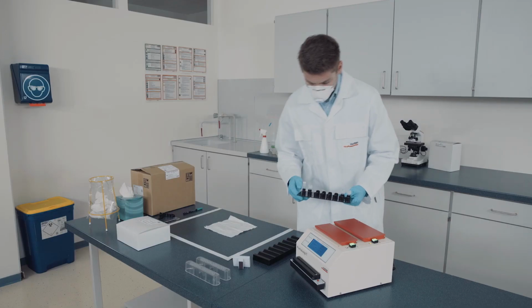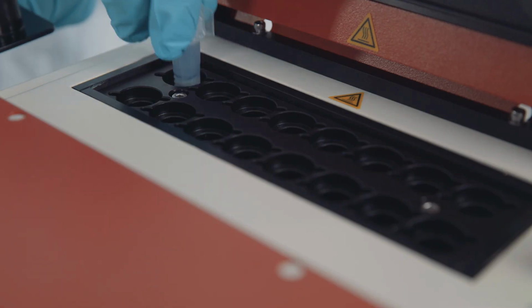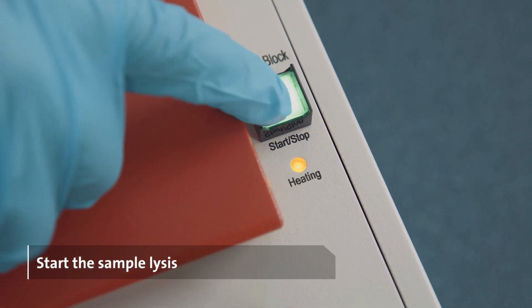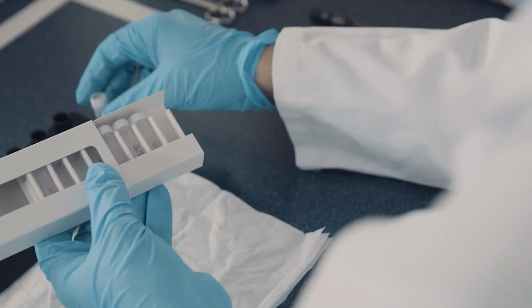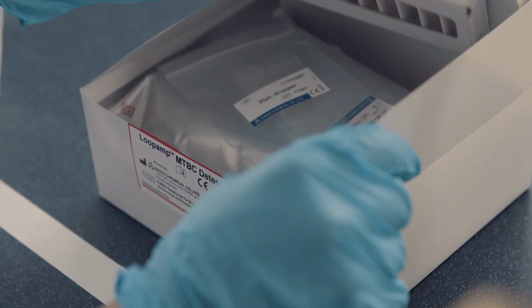Check the temperature of the heating block. It should be 90 degrees Celsius. Put the tubes into the heating block. Now start the sample lysis. The remaining time for each step is shown on the display. Meanwhile, put the negative control back into the Loopamp MTBC detection kit.